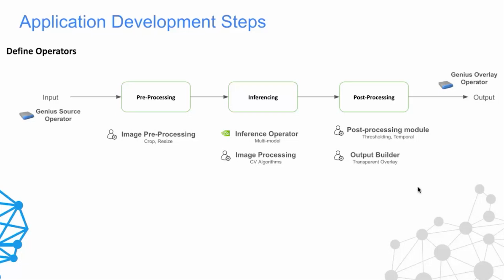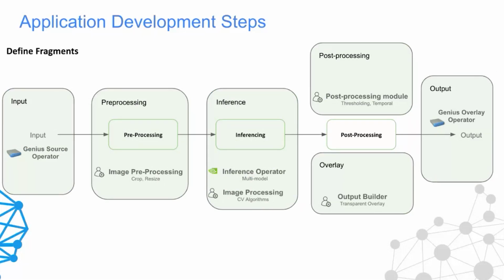Once you have defined all the operators, the next step is to group them into fragments. Whichever fragment processes whichever workload is totally based on the workload of each different process. It will totally depend on the type of application that you are building. In our case, the input part was done with a different API and had different resource requirements. So that is why we have clubbed it into a different fragment.